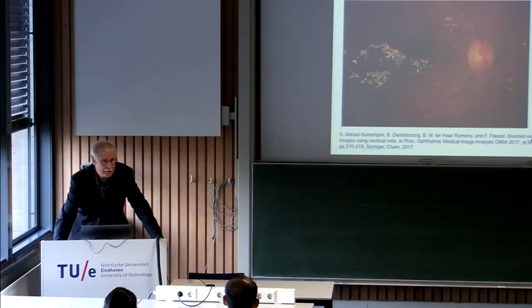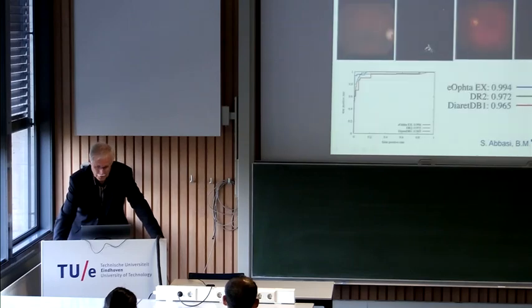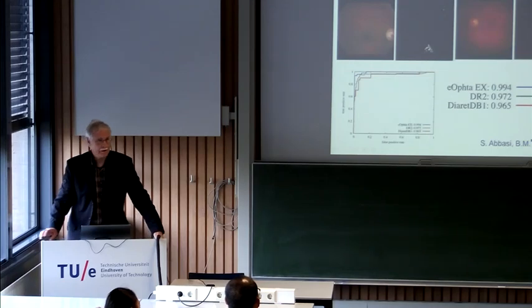I mean, then you don't need to burden the doctors with drawing all this. Of course, we compared it with what the doctors did. They did not annotate every individual thing, but they drew with big areas. But you see the numbers, 99, 97% right. This is really, really good.